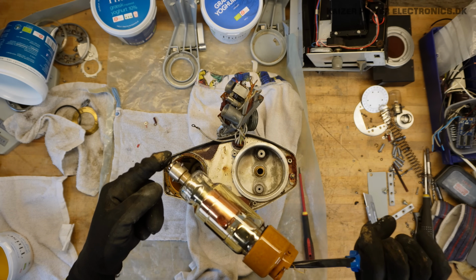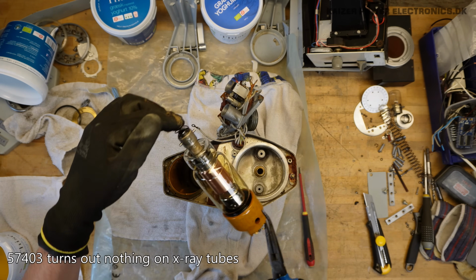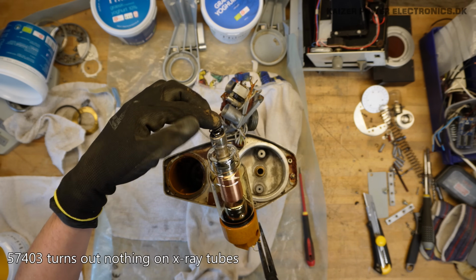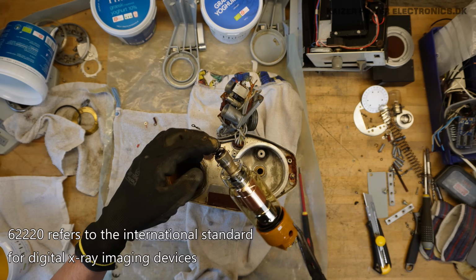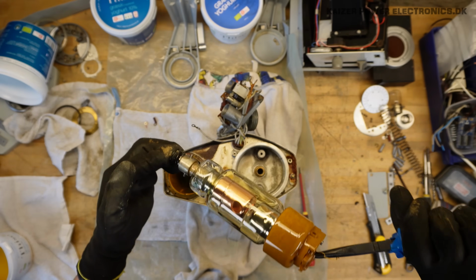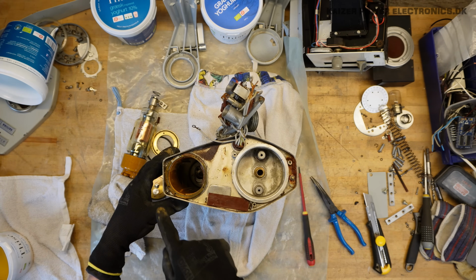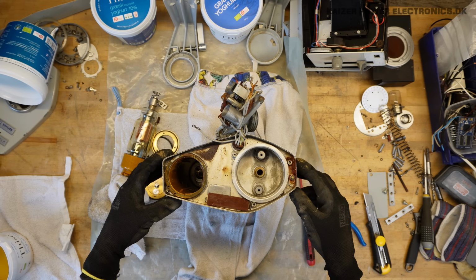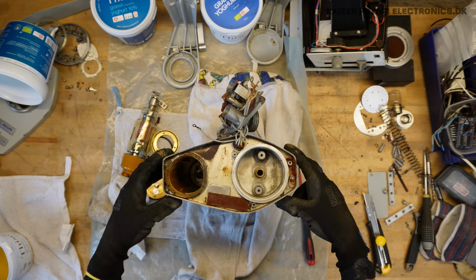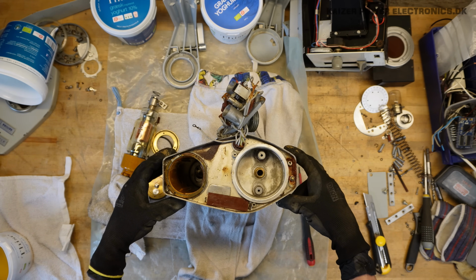It's marked 57403. And up here we have 62220. It doesn't seem to have any other markings. Opening it up further is most likely only to knock it open here. That's most likely soldered, and I have before just used a hammer and a chisel to get that knocked out. So I think I'll try that method one more time.